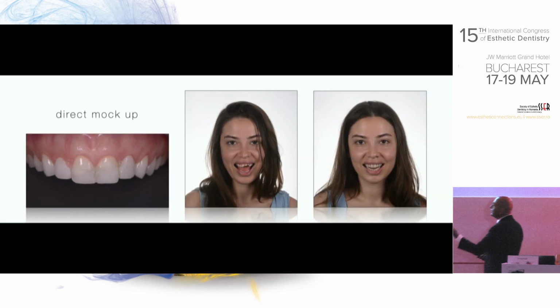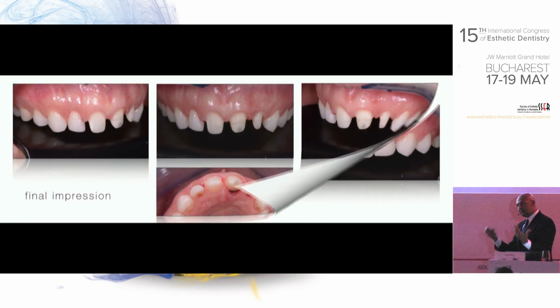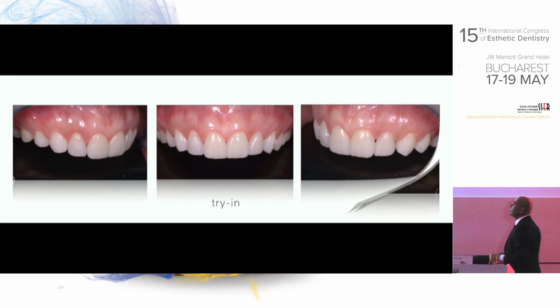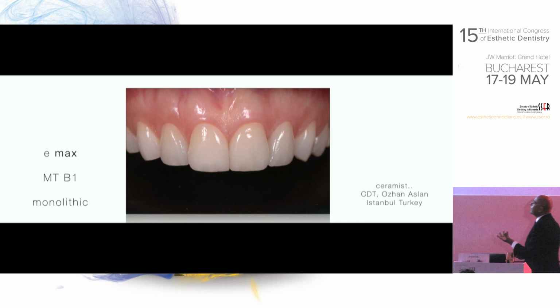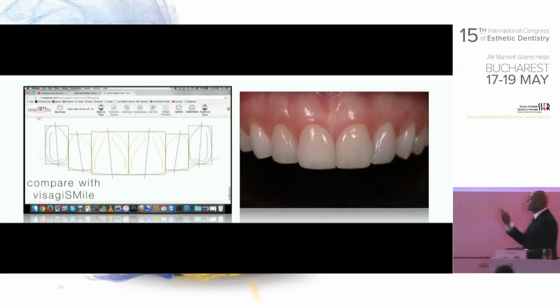This is the first day when I did the direct mock-up, and then when we made the final impressions after the teeth were treated for a couple of weeks. Now these are the veneers after a couple of weeks, try-in, and 2 months post-op. Now, how did I come to this result? Actually, let's see the relationship of this with the Visagist Smile.